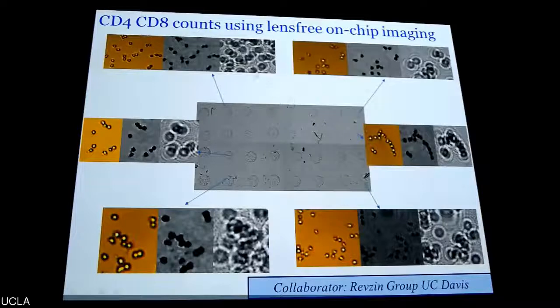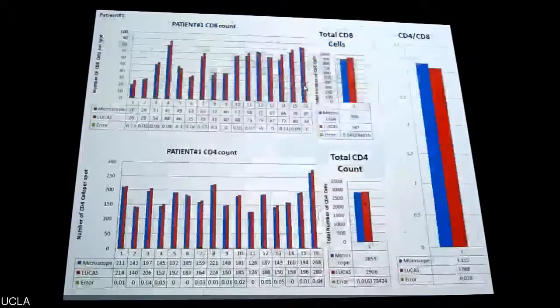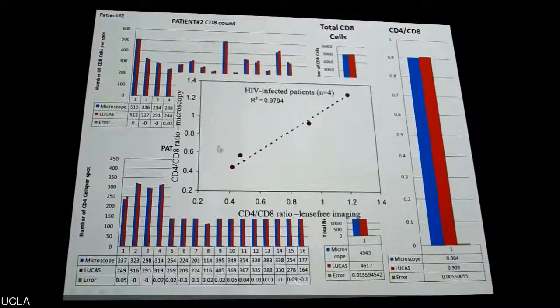On the same chip, you can also have CD8s. This is used for reference because the ratio of CD4 to CD8 is decreased. That's when you can understand when the antiretroviral therapy needs to start. If you zoom in to these different spots, this is how it looks for CD4 spots. They are reconstructions, and this is how it looks for CD8s. In general, for a healthy patient, there is a greater number of CD4s per microliter of your blood compared to CD8s. But once HIV kicks in, this becomes sparse. That's when you understand what's going on. Typically, for a healthy patient, this ratio is more than 2 to 3. But once HIV kicks in, this drops to subunity, and that's when you can understand something's going on in terms of HIV replication and viral load in the patient.